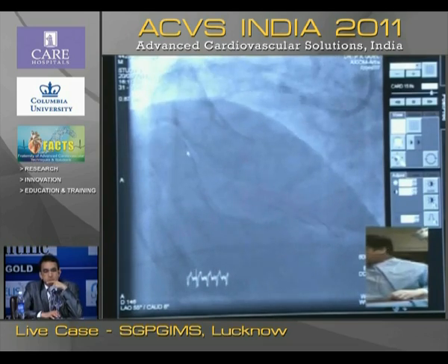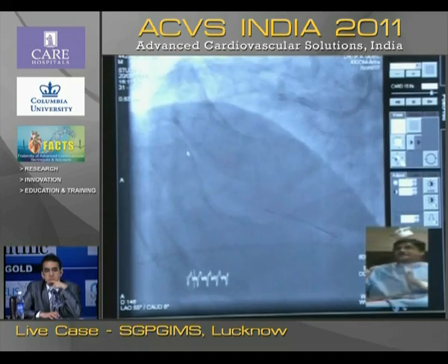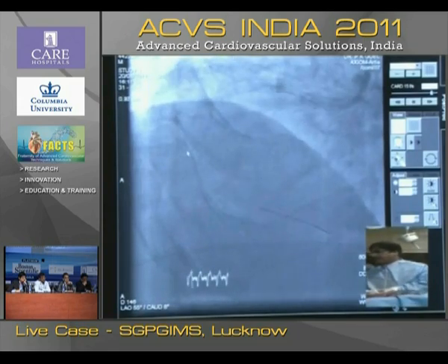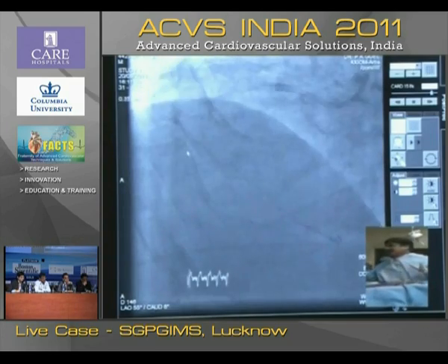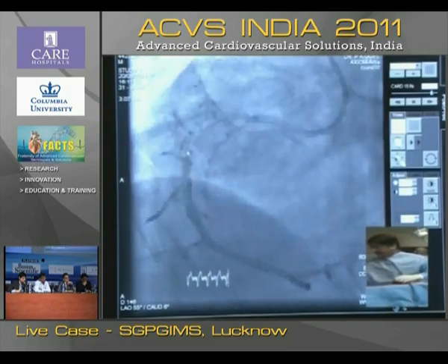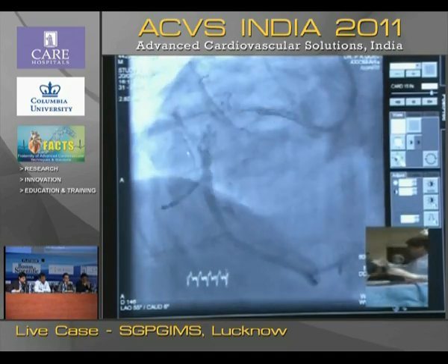Yes. So you need it at that time, and then you need it sometimes when you're doing a left coronary, and the angle of takeoff is different. So you need a different curve for the angle of takeoff and a different curve for entering the CTO truly. There again you need a microcatheter so that you can put that type of curve on the wire which will negotiate the lesion. Otherwise, the curve needed for hooking that vessel, for the angle of takeoff, will not be optimal for exploring the CTO. I hope you get that. Yeah, you are so right. These are some areas where a microcatheter is very essential.